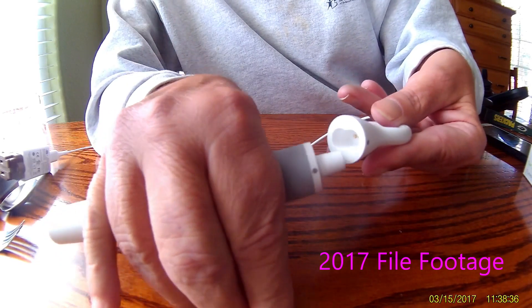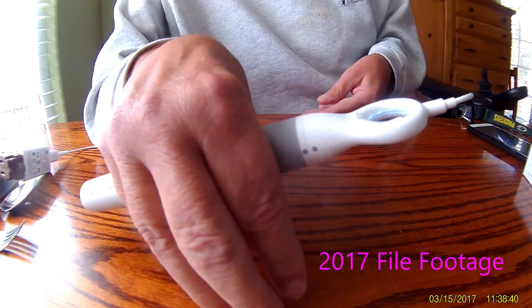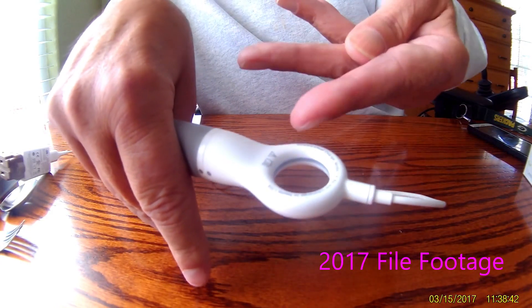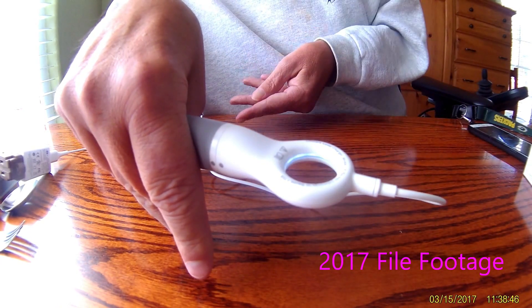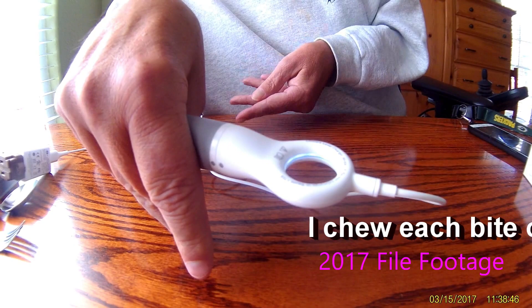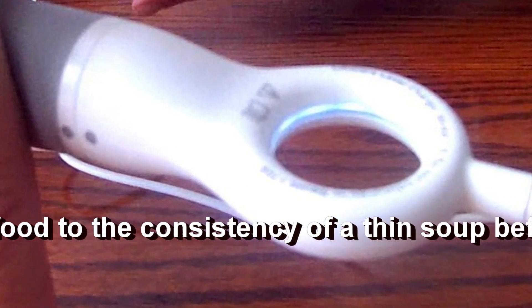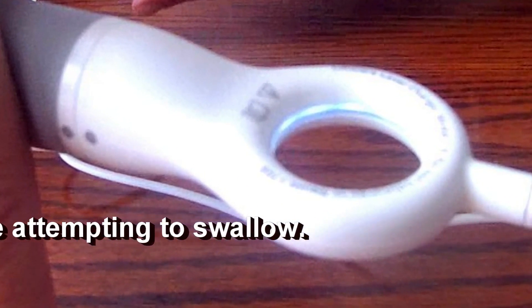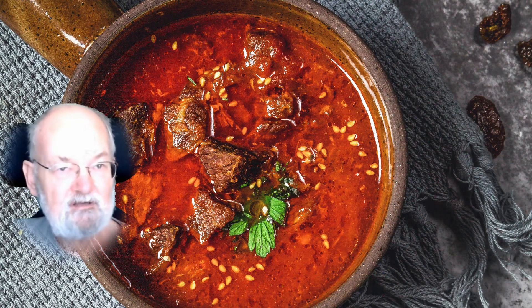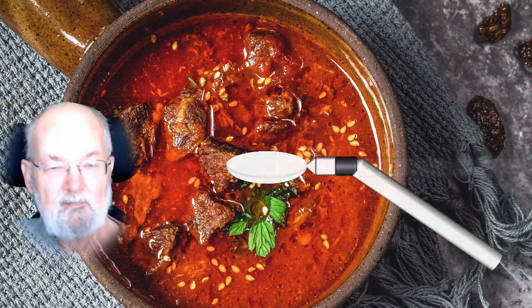Charging the Liftware Level is easy too — just line up the charging cord dot with the dot on the device handle. The ring on the charger attachment flashes during charging and turns to a solid light when completed. I've never run out of battery life, which is great considering how long an IBMer must chew each mouthful due to our IBM-inherent swallowing difficulties. After three years of use, I'm still happy I purchased this Liftware eating device for my inclusion body myositis.